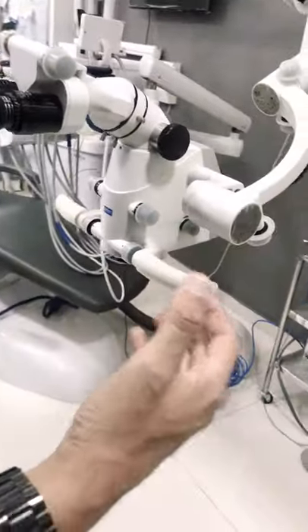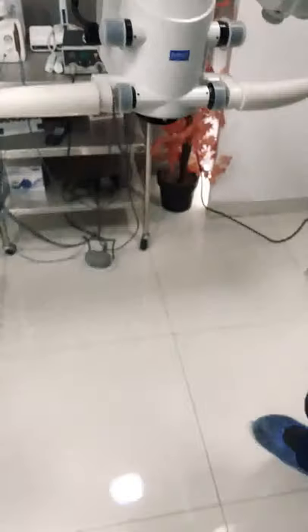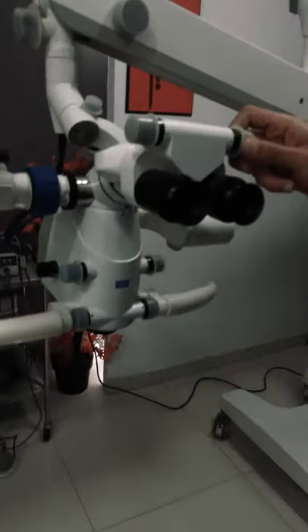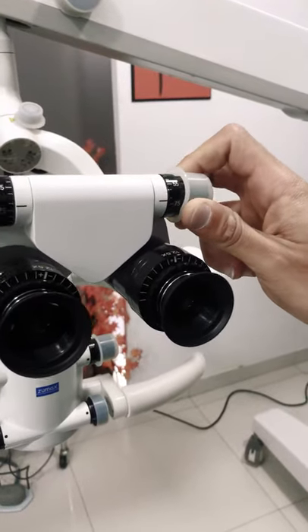There is a light control that increases and decreases the intensity. On the other side, you get the filters: an orange filter, a blue filter, and a beam collimator filter. This is a really nice advantage. The light intensity is a little bit less than the Leica microscope discussed earlier, but still very suitable for clinical work. You also get controls for the IPD distance using your fingers to control that easily.